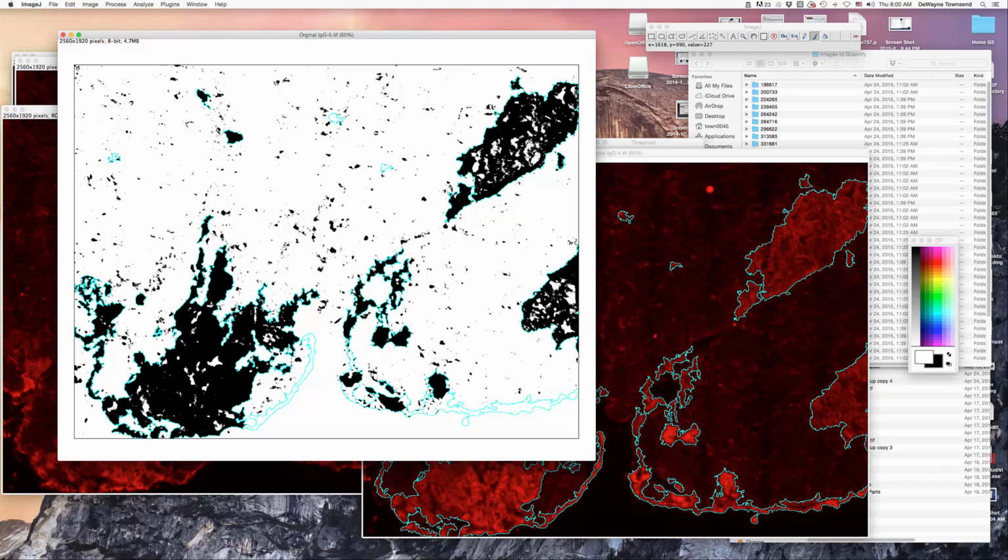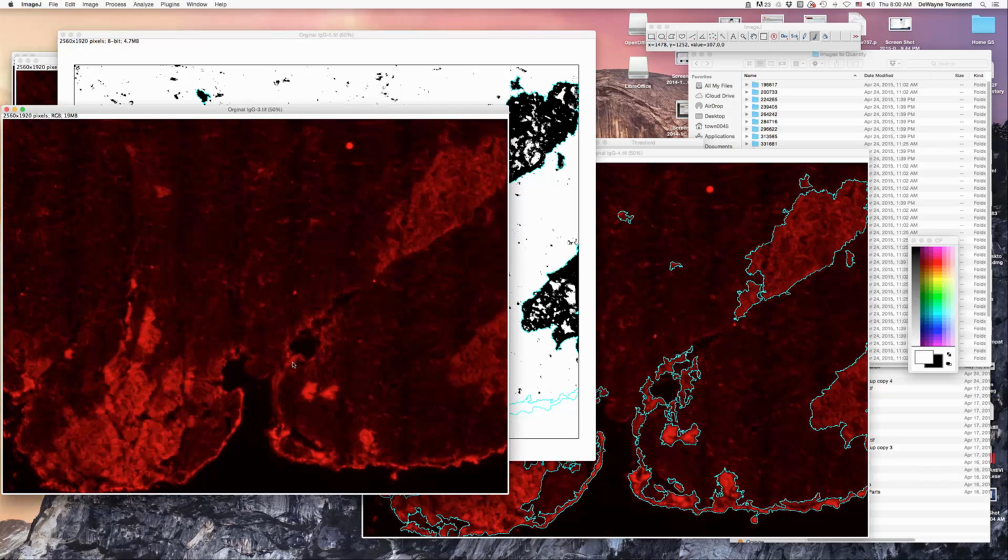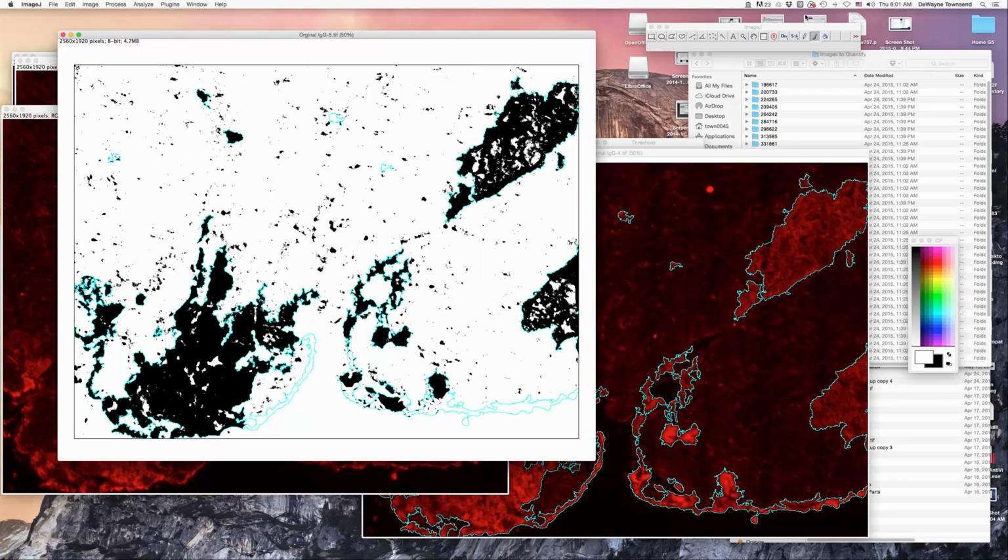Alright, so then this whole area up here again is all just noise. There's no real myocytes there. I mean, there's maybe a little artifact in the tissue. It's hard to say. So what we want to do is get rid of all of that positive area. So again, I'm going to go back to my big brush to remove most of these areas here. Now you can see what's happened is I accidentally selected the yellow one. So I'm going to deselect all. Start over here. Alright, so working my way up, just removing large areas of noise.